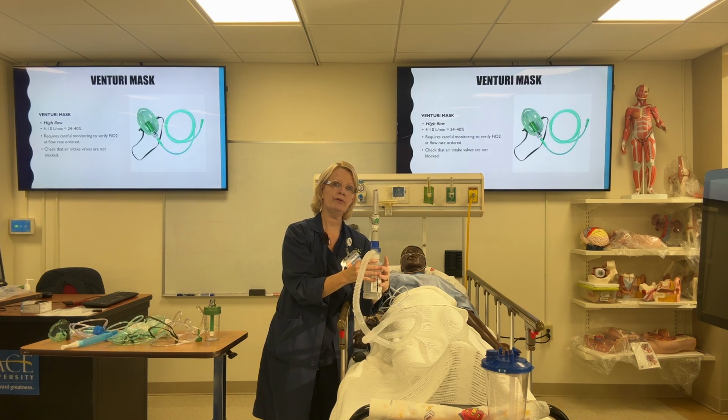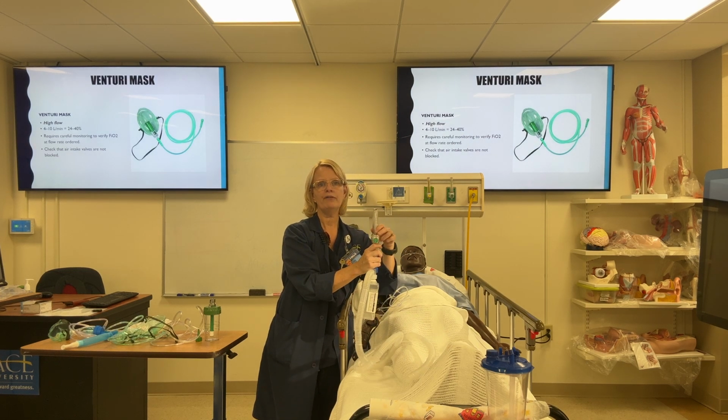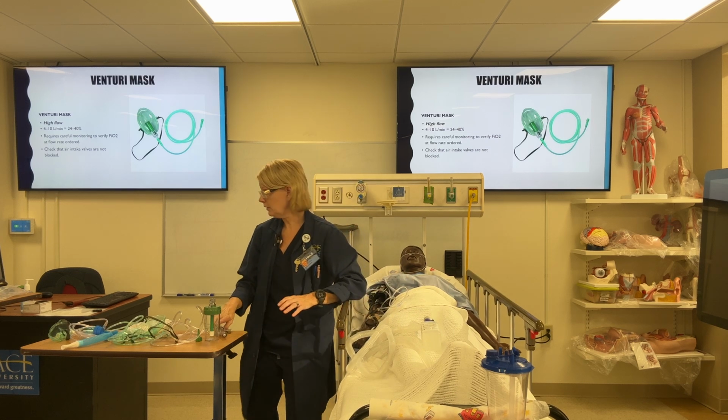It's just more of a comfort measure for the patient. It doesn't dry out their mucous membranes as much, and I find it keeps patients from coughing or just from having laryngeal spasms and things like that. So it's always good to have them on humidified oxygen when you're at those higher percentages.